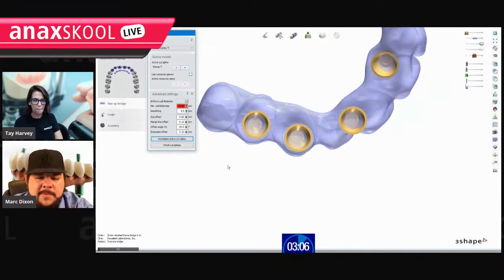So when we're watching a webinar and people are actually having problems, which I am right now, because it's going to pop up again. It's not going to go. It's not going to move forward. And I know that. They enjoy it because it's like, okay, I'm not the only one. Yeah. But I'm telling you right now, if it did move forward, because of tooth number 9 and that insertion path, there isn't blue, so it's going down. It's giving me an issue.